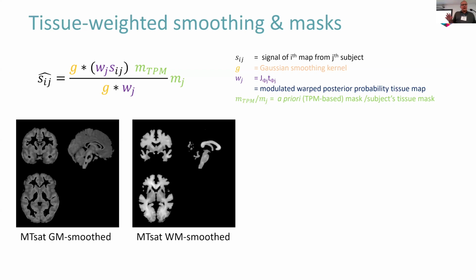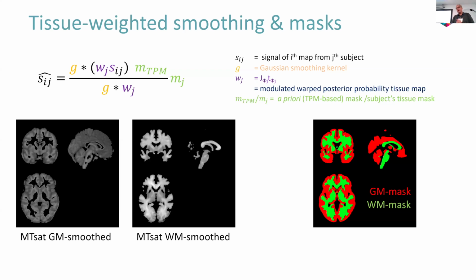Those images, as you see, I call them popcorn images because they sort of blown up gray matter, blown up white matter. And to make sense of them, typically we also rely on a gray matter mask or white matter mask that are not overlapping. So pretty much we decide that this voxel should be considered as gray matter, and that voxel should be considered as white matter.